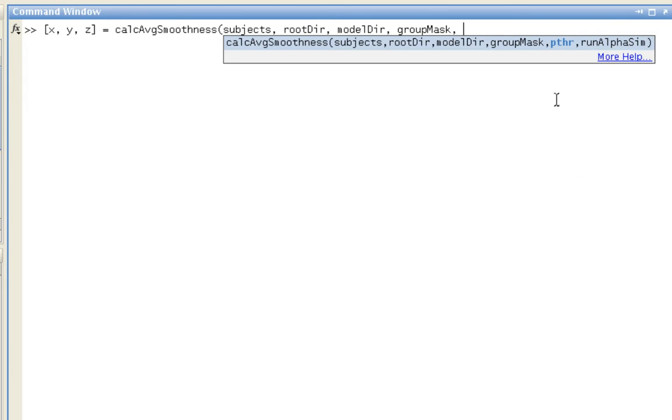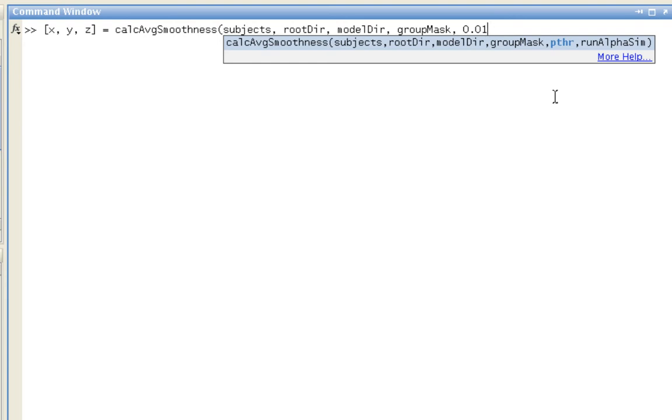P threshold refers to a voxel-wise uncorrected P threshold that you'll be using to feed into CLUSSIM to estimate how many contiguous voxels you need to pass a given cluster threshold. For example, if I just want uncorrected P thresholds of 0.01 for each of my voxels, how many of those voxels do I need to cluster together in order to pass different correction thresholds?